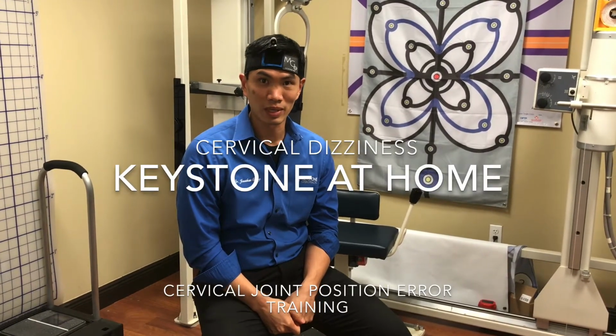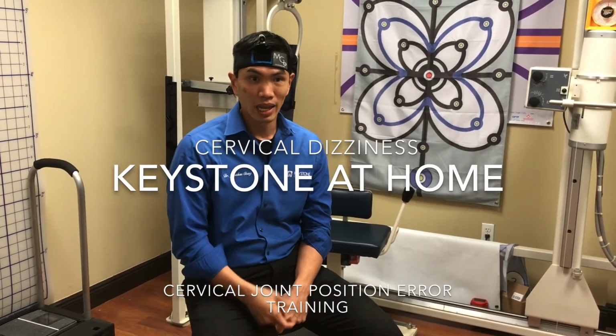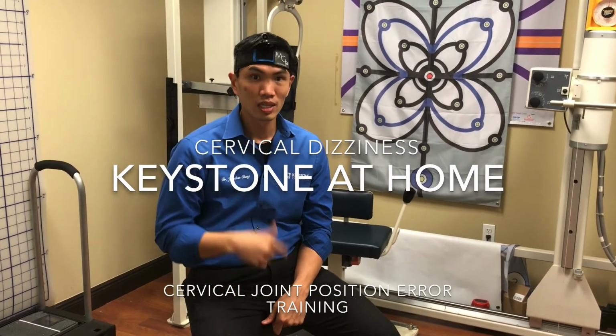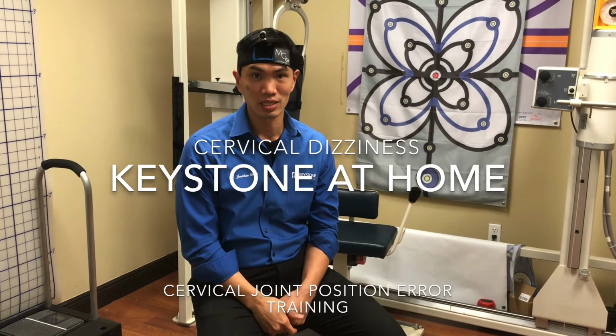Today we're going to be talking about an exercise that we use for something called cervicogenic dizziness, or dizziness that's coming from your neck. And what you can see on my head is a little headband with a strap with a laser attached to it. This comes from a company called Motion Guidance, and basically we use lasers to give your brain visual feedback about where your head is in space.